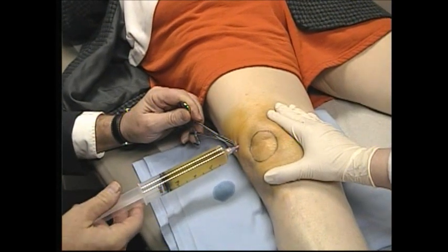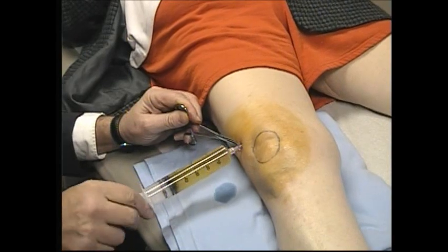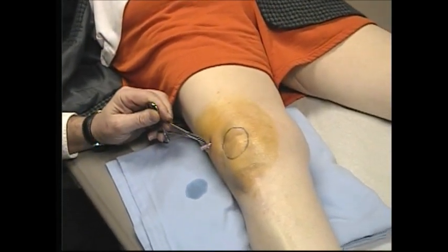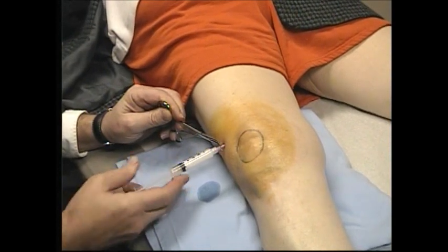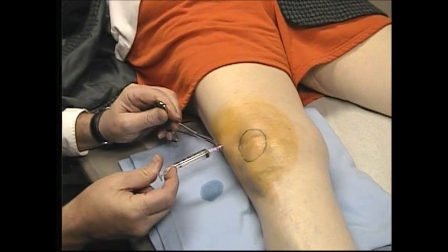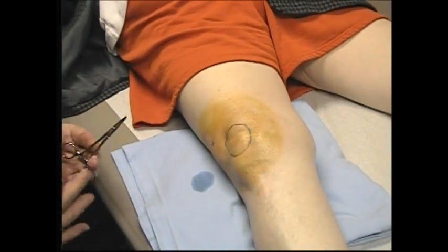Now we're starting to get a little bit of hematoma — that'll be from the veins in the area. That's okay, Louise. We're going to be done now. We've gotten out a total of about 90 cc's. She's had this evaluated at her rheumatologist's office, so we're not going to send it for additional studies today. Then we just come in, use the same needle, and inject. And then we're done — Louise is going to clean that up and give her a band-aid.